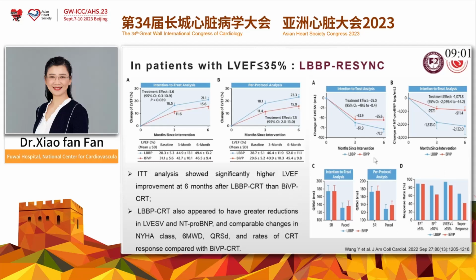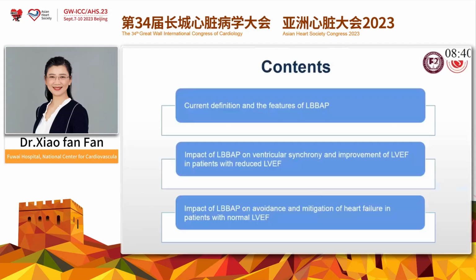And for other parameters like the LVESV, and the BNP, NT-proBNP, LBBP also resulted in better results.